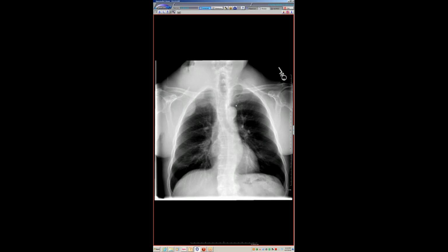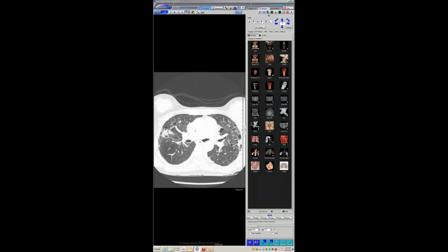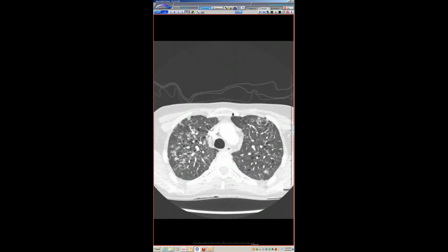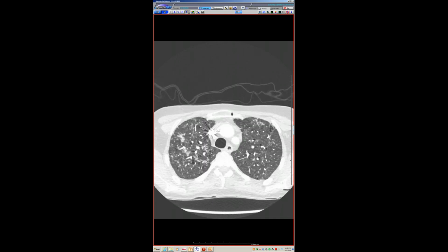I would say that the findings that you had before the person got the second transplant in the right upper lobe just look like lung scarring to me. It doesn't look like PPFE in the setting of idiopathic PPFE. It's just lung scarring. I don't think PPFE is a very good description either. I think it's a lung scarring process, and I don't think histologically it is that similar to PPFE in the idiopathic setting. So I think we should just call this lung scarring, presumably from chronic rejection.